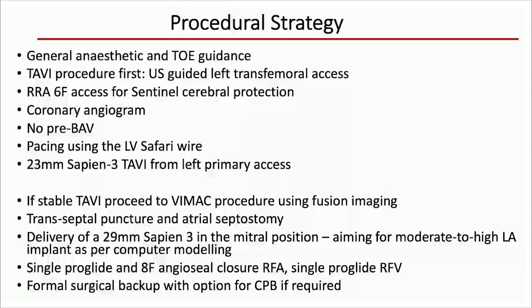on the FEOPS platform. Single ProGlide and 8 French Angio-Seal closure device through the right femoral artery with a single ProGlide through the right femoral vein, and there was formal surgical backup available with an option for cardiopulmonary bypass if required, as would be the norm in all cases which are associated with a high complication rate.